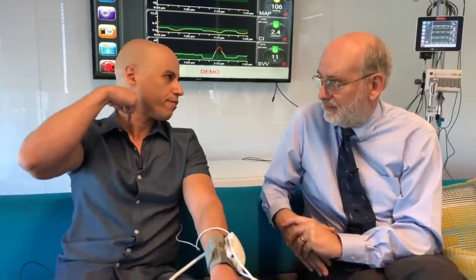That's what makes it really interesting to me, because I trained in the world where you put in a Swan or an IV catheter and you check CVP, and that's how you resuscitate. Now, because we have the ability to analyze large numbers of data points, we can create algorithms that can predict hypotension. That's a whole other world. That's computers. But sticking with this for now, this device, the ClearSight, in real time will look at my blood pressure, which is still quite high.